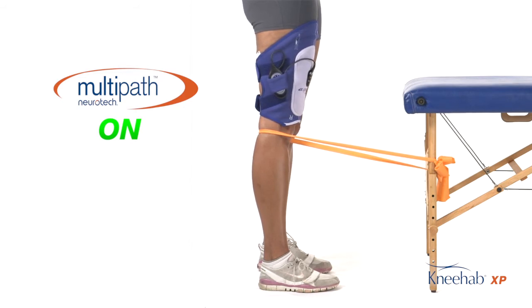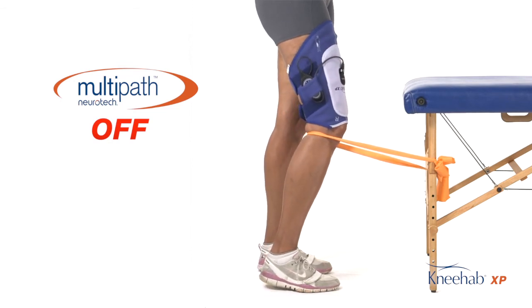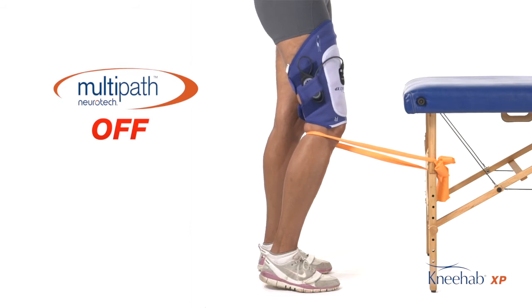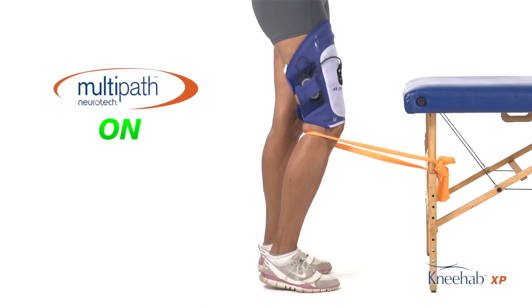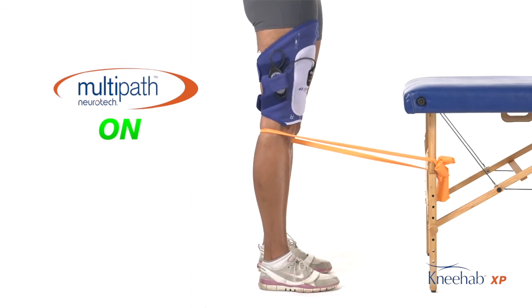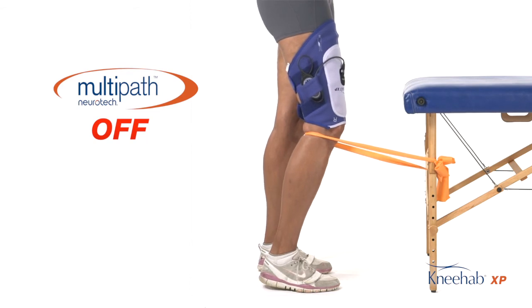When the contraction on the device releases, the patient also relaxes, allowing the knee to sag into a slight bend. The heel may come off the floor slightly. When the next contraction comes on, the patient squeezes the knee back straight, pressing the heel down against the ground as the knee extended position is held. This series is repeated with the timing of the contractions on the device.